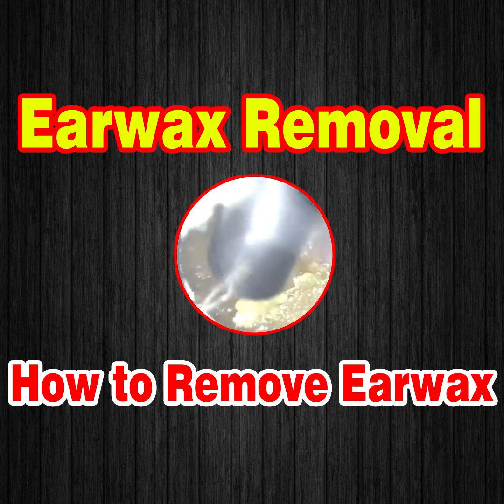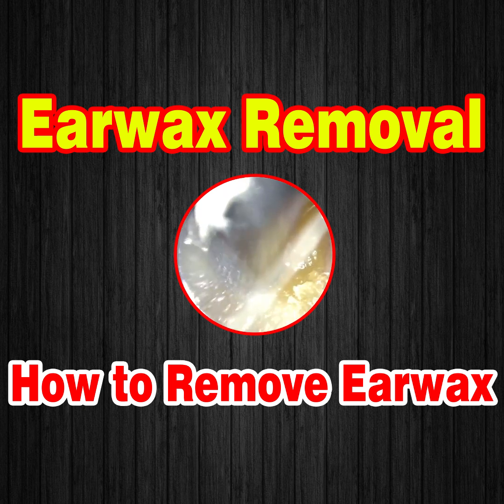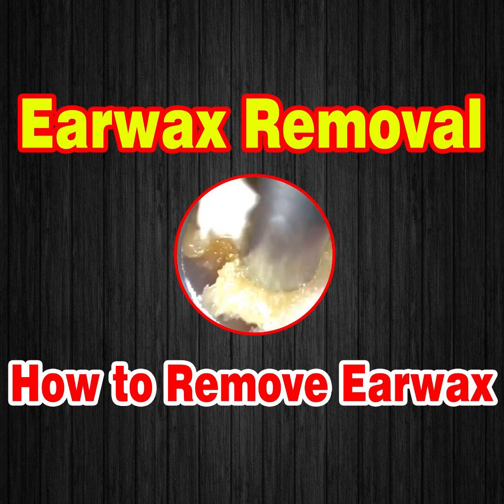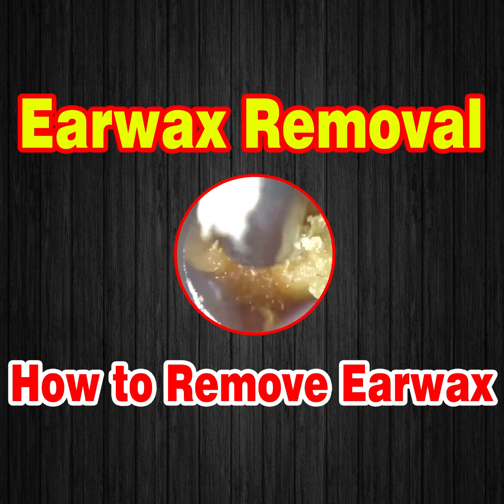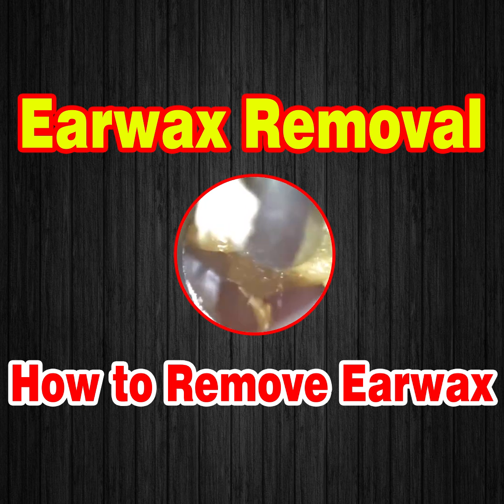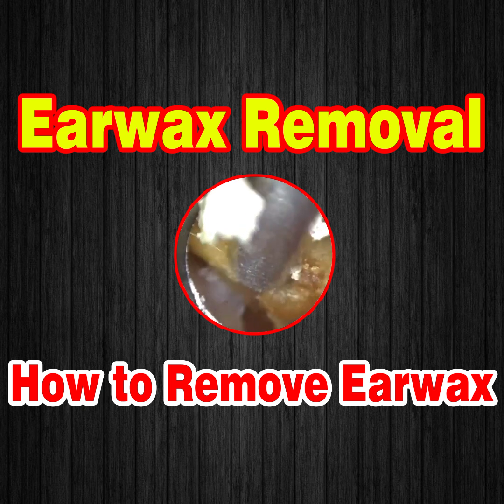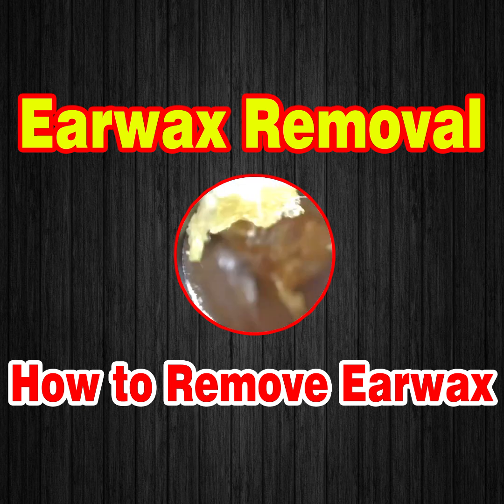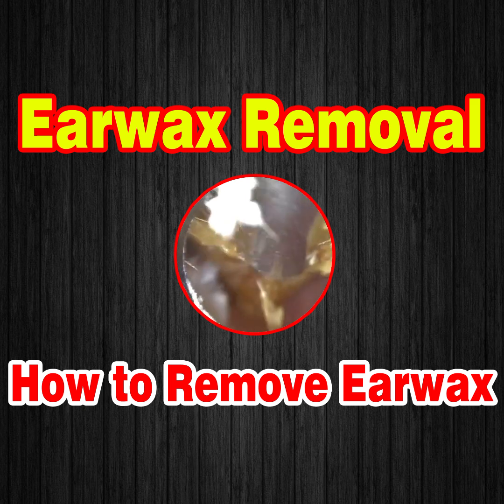Now, this ear was quite a tricky case, I'll say for a couple of reasons. First of all, the patient's ear canal once more was very bendy and twisty. But this is their worst ear, and they've used a lot of oil drops prior to attending, and they already have soft wax. There's a lot of keratin, a lot of dead skin involved here, which gave it a very mushy consistency. So on this side, I've removed the majority of the wax, but there was some left in the anterior recess, and that's where, again, you can't compete with an endoscope in terms of removing wax from the anterior recess.